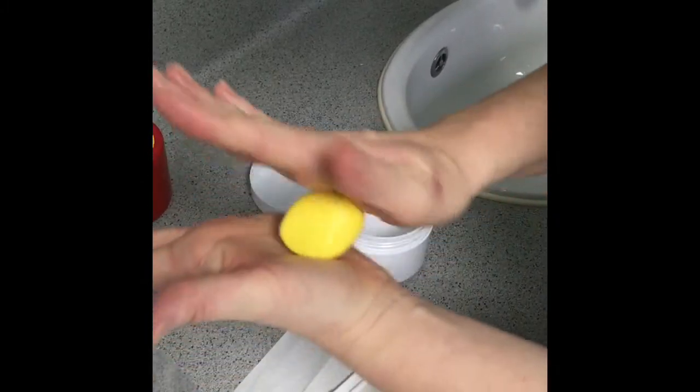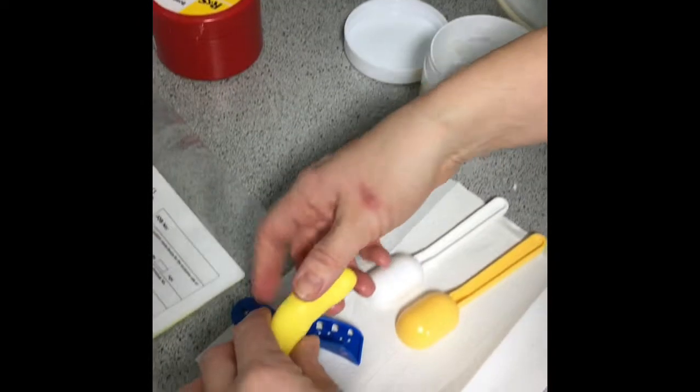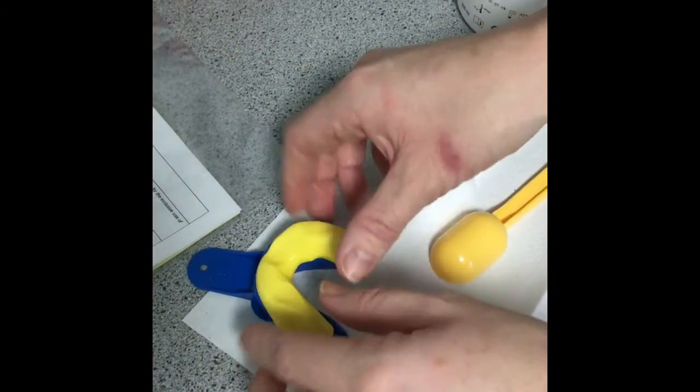Look at the size of your tray — roll the putty into a ball first, then roll it into a sausage to ensure it fits in the tray. Hold it at the front, pull it out until you've got the correct length for the tray, then push it in.